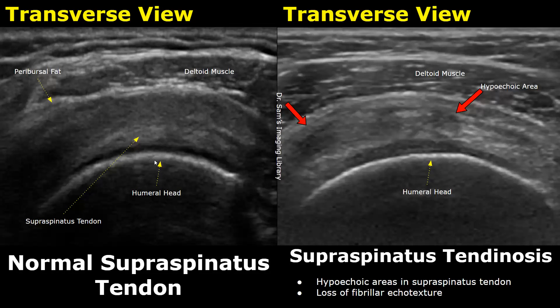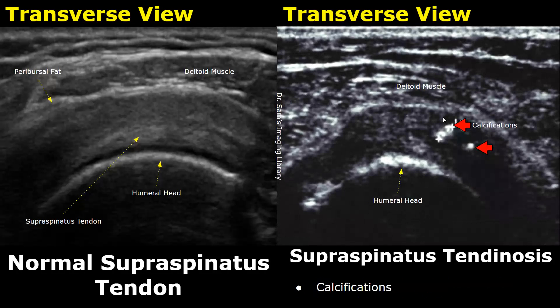This is a case of supraspinatus tendinosis. In this condition, we will find hypoechoic areas in the supraspinatus tendon. In some cases of tendinosis, we may find calcifications — we see hyperechoic calcifications within the supraspinatus tendon.